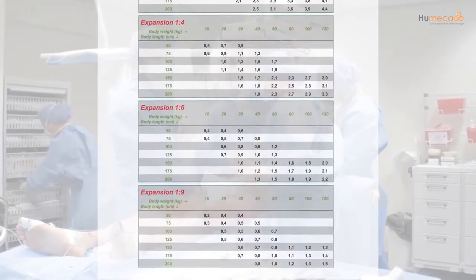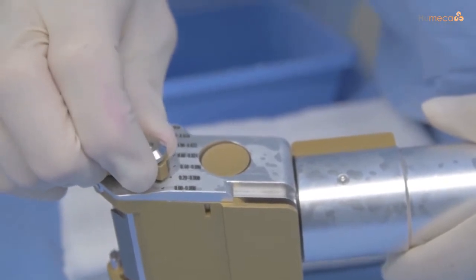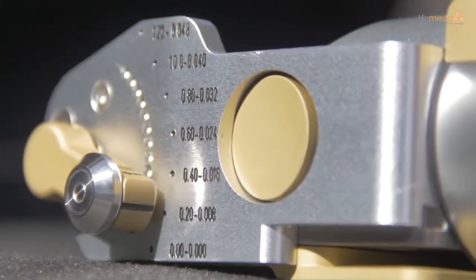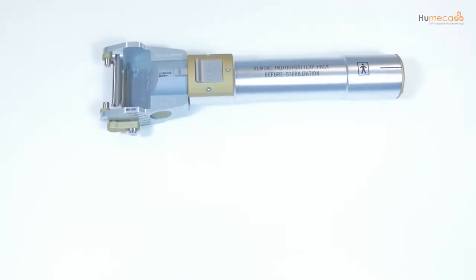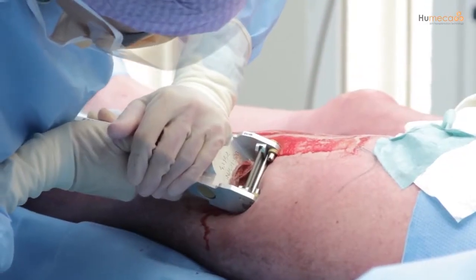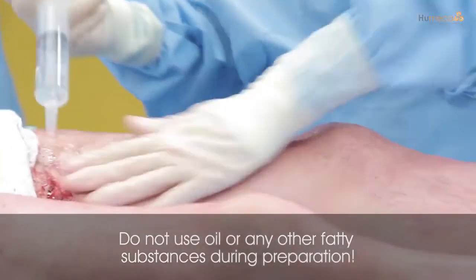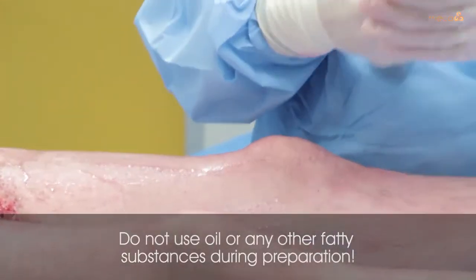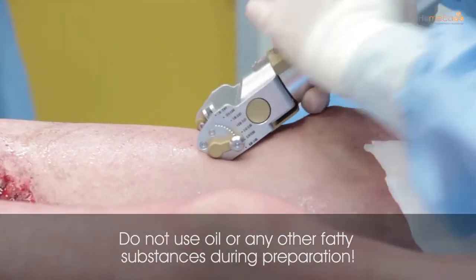A split thickness skin graft between 0.2 and 0.3 millimeters is often used for harvesting. It is recommended that the D42 dermatome is used, as its dimensions are specifically designed for the Meek technique. It is very important not to use oil or any other fatty substances during preparation of the donor site.